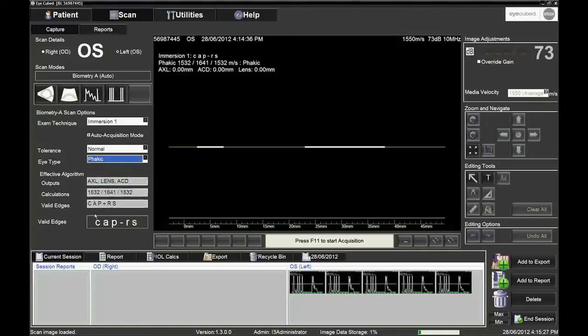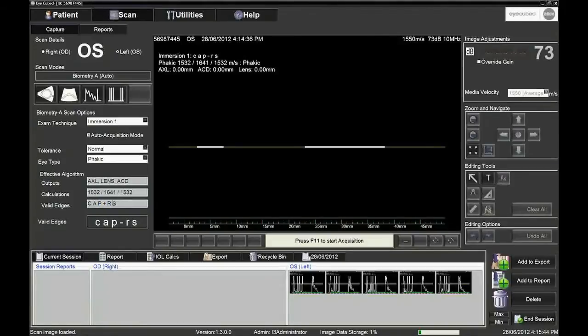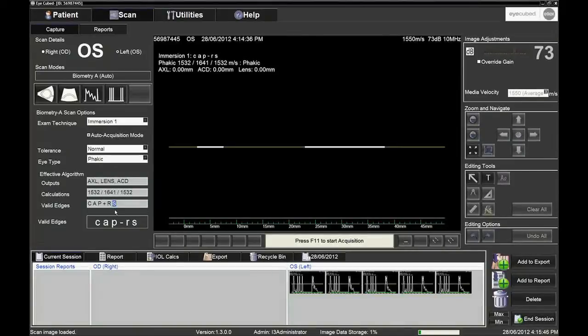In this example, the patient is phakic. The system is looking for C, the corneal spike with its two peaks corresponding to the anterior and posterior corneal surfaces. Then A or anterior lens spike, then P or posterior lens spike, then R or retinal spike and lastly S or scleral spike.